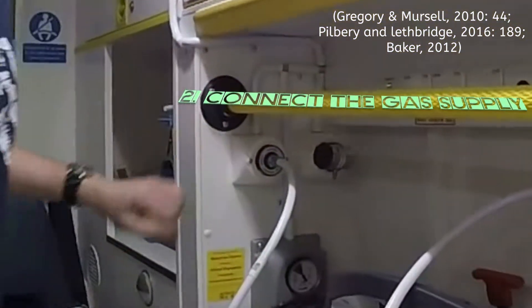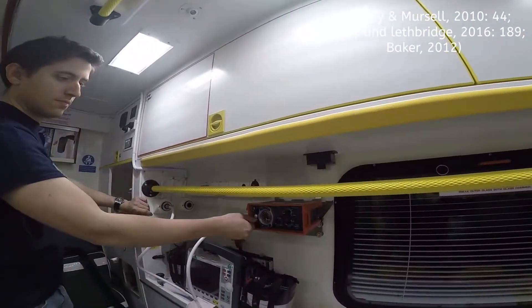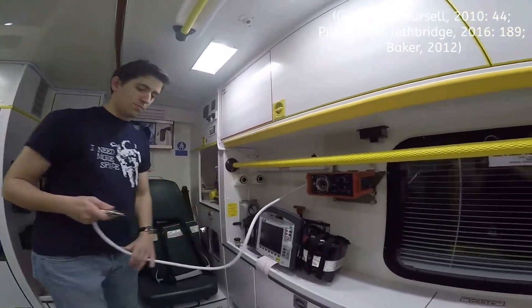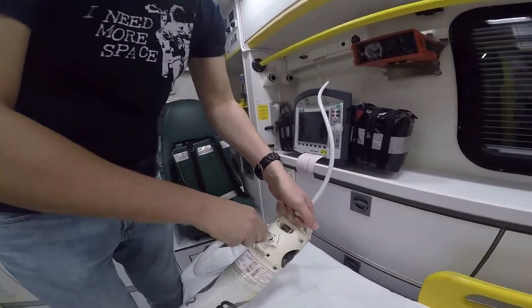To connect to the gas supply, push the hose into the socket and twist. When you turn it on, the ventilator should complete a self-check. The alarm lights should flash in sequence. There should be one burst of the high pump. It's the same when connecting to the portable oxygen cylinder.